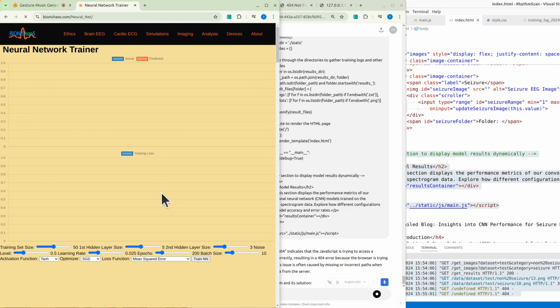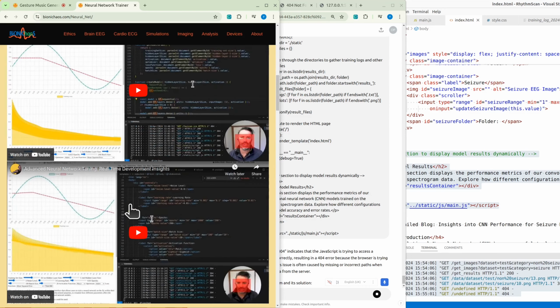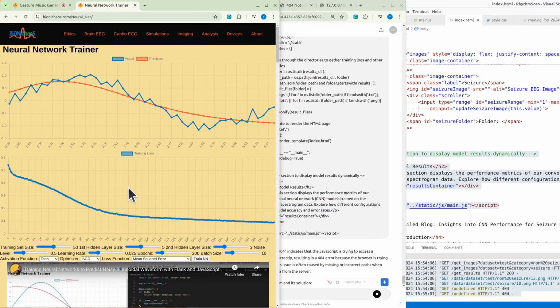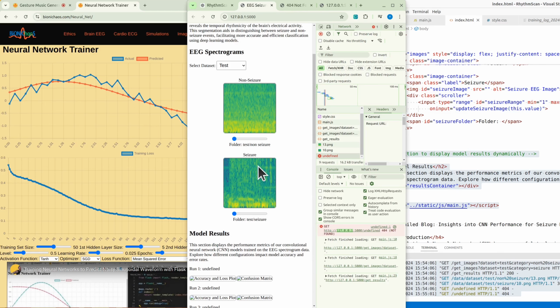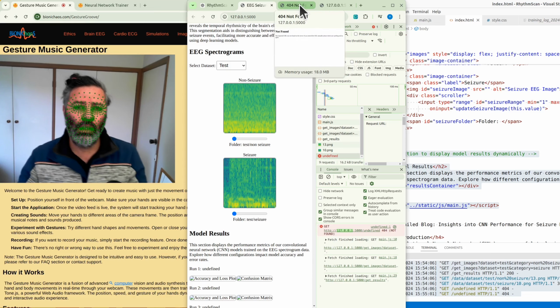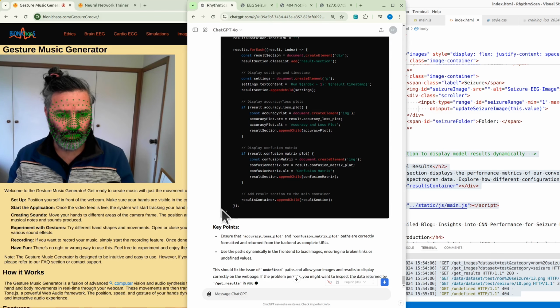We have some neural network training, basic training, as well as videos of me actually training it. That's a good point. So when we actually publish this, we will have the videos of me developing this stuff. So that will be hopefully a bit easier to follow and understand.